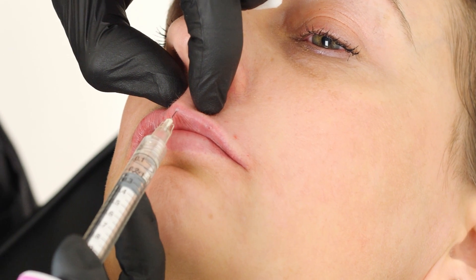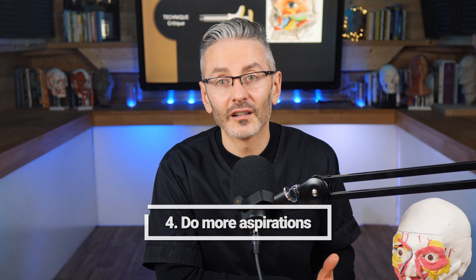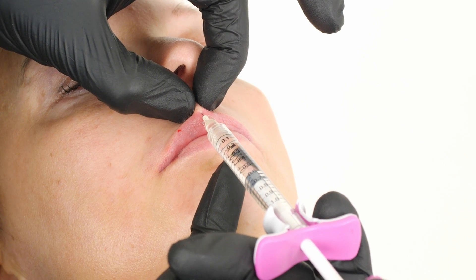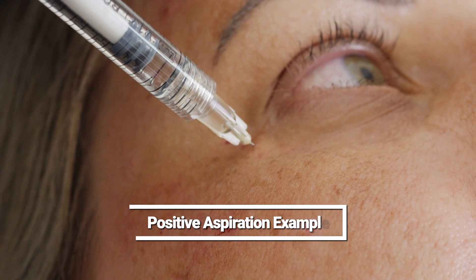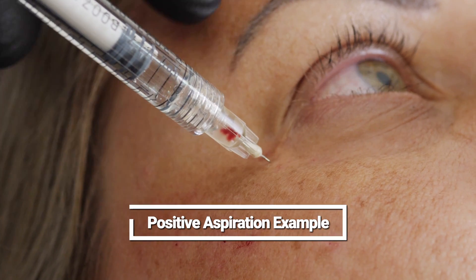We get positive aspirations at the top quite often in aesthetics and there is no need to go quite so deep in most people. The needle is running parallel to the artery, so you could also increase the number of aspirations. When you're doing a linear thread, you can aspirate as many times as you like. Two or three times I think would significantly increase the sensitivity of aspiration in terms of picking up being in an artery. Mathematically, each negative aspirate decreases the probability of being in an artery prior to injecting, and it takes no time at all once you've got used to it. It causes no harm, so the benefits in my view outweigh the risks quite clearly.